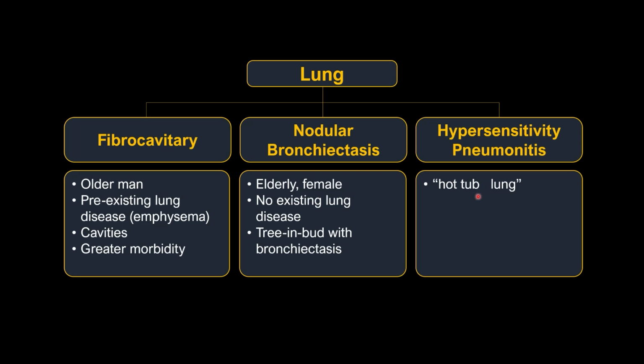So for community-acquired pneumonia, you see an opacity. The patient gets treated with antibiotics, and then 6 to 8 weeks later, you'll get a chest CT or a chest X-ray, and the opacity will be gone. That's not the case with these infections.